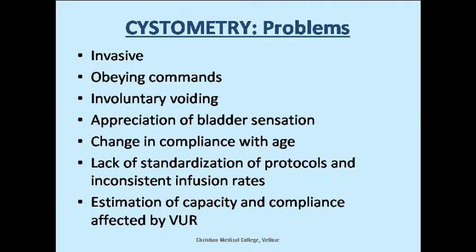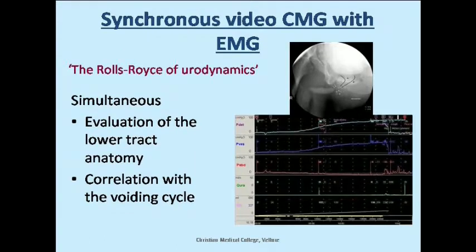I have had patients referred to me for ruling out overactive bladder in children. What we found is a bladder stone, because they never actually had done a KUB. So sometimes people get very, very impressed with urodynamics, and I think that's a mistake. Urodynamics does not replace basic sound clinical medicine, and it only comes as a complement. A video CMG is a Rolls Royce.